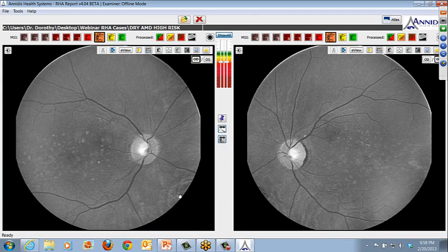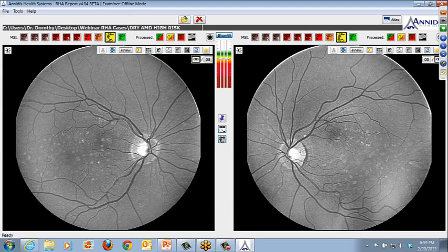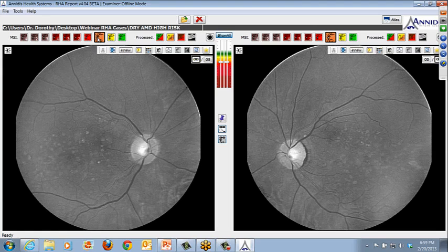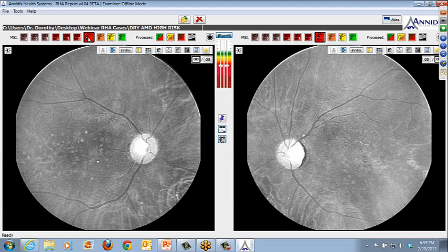Okay, so if you think back to the AREDS definition, the AREDS category 3 includes at least one soft drusen as well as RPE atrophy. And in this particular patient, you can actually see both hard and soft drusen. Even though they're sub-RPE, they're large and big enough, and they're hyper-reflective. They absorb light differently than the RPE. So you're going to see those in the image, even in the higher wavelength views, despite the fact that their position is deeper in the retina, okay?